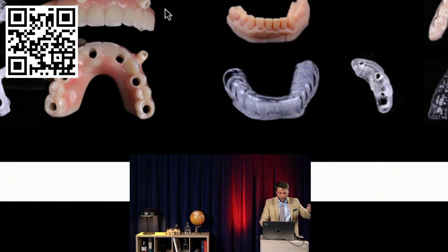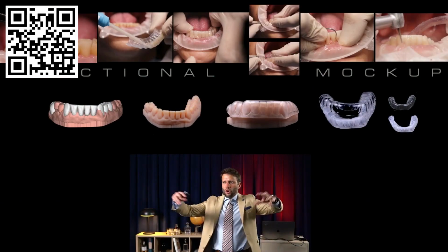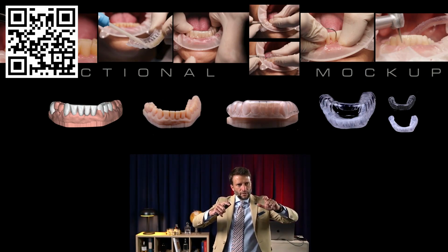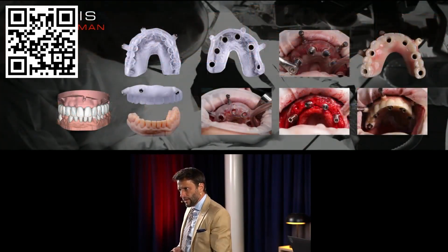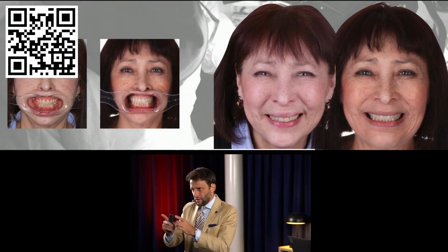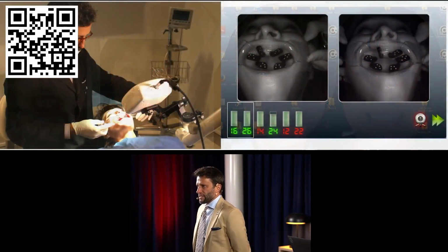And after the lower, we will capture the upper denture over the implants that bites perfectly with the composite on the lowers. Now, your digital lab needs to play the sequence, right? You and your lab. So you see, step number 1, you capture the implant first, then the composite on the lowers to level the lower arch, and then you do the implants on the upper, exactly like the digital 3D design. And in one session, the patient has a lower arch completely new and the new upper prosthesis.